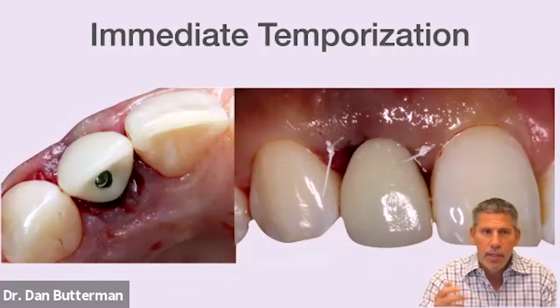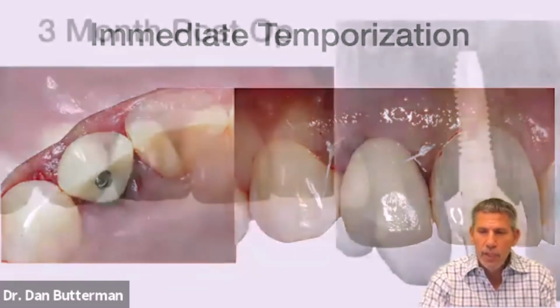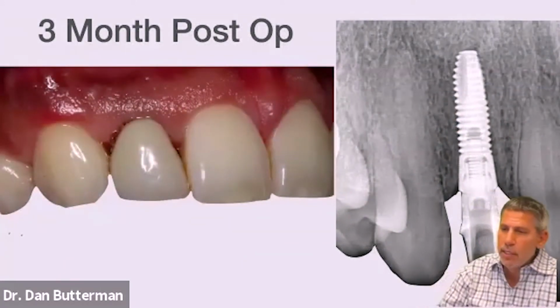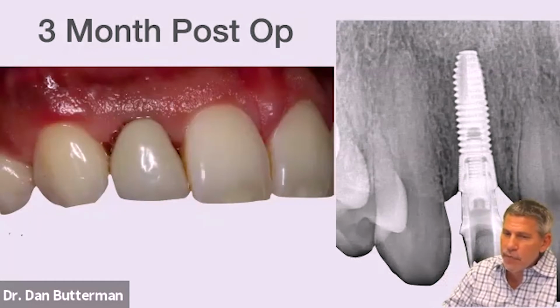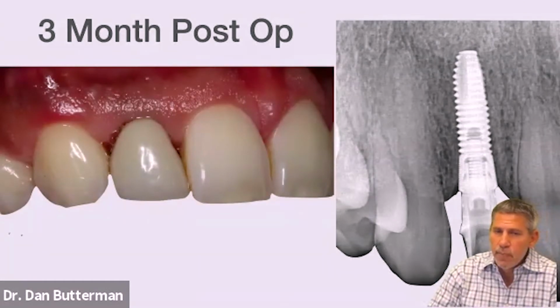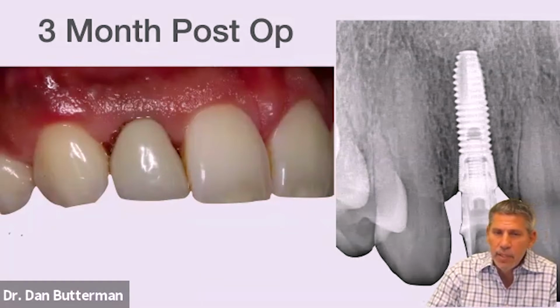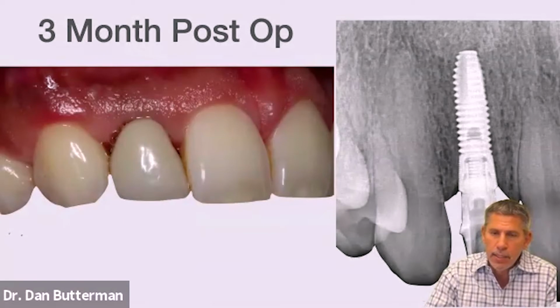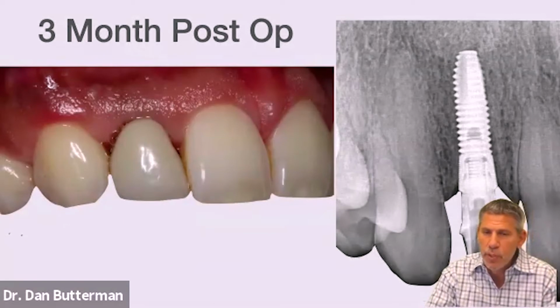on that temporary. So now the patient leaves and they return about 3 months later, and the implant is integrated and everything is looking good. So on this particular case, and you can kind of see it a little bit here, this was an immediate extraction, and the implant was placed and a temporary was placed on.